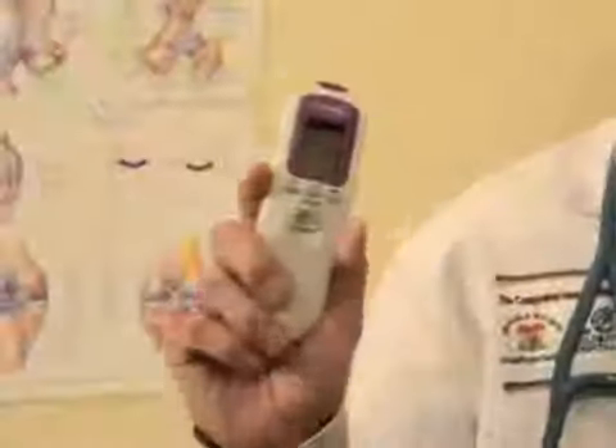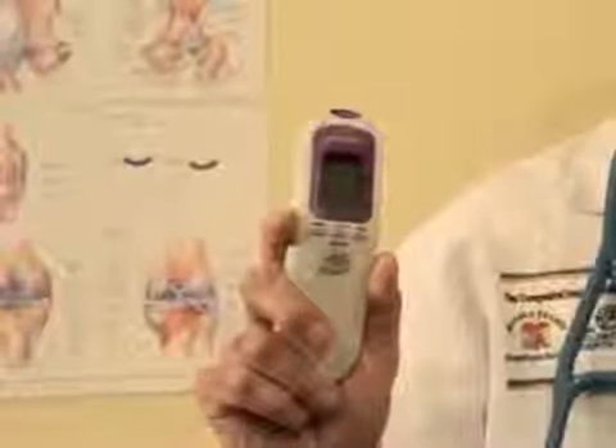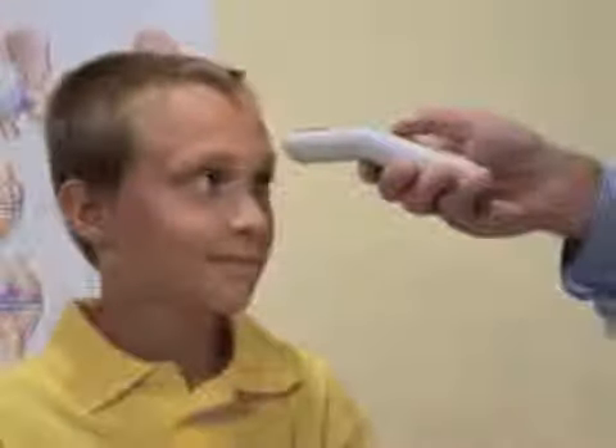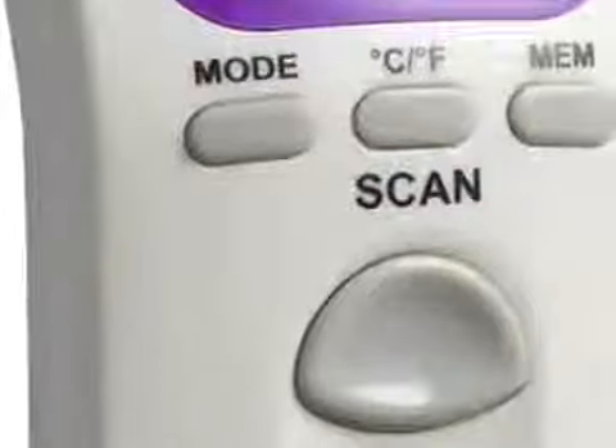The advanced proprietary algorithm of the Veritemp is designed to take temperature readings from the forehead. To use, place the Veritemp about three finger lengths away from the patient's forehead and click the scan button. Body temperature is read instantly.